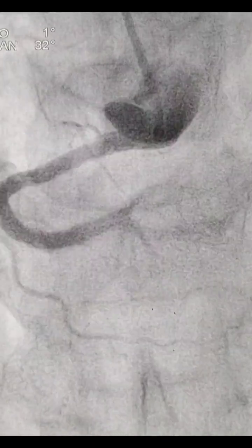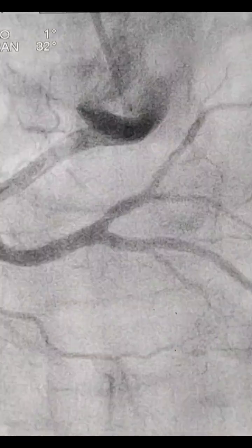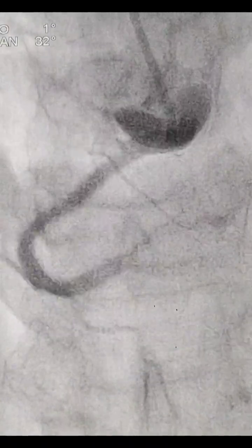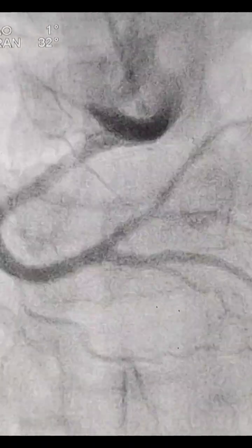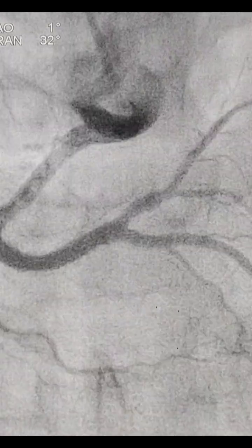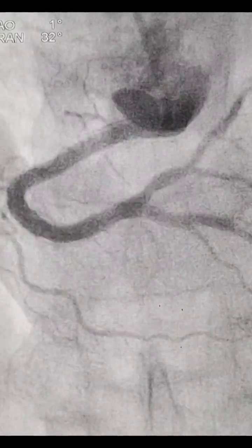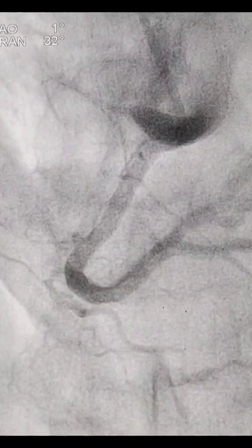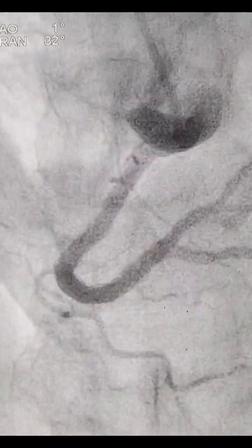But anyhow, I kept this patient for 5 days and there was nothing. So I planned for the CT aortogram for this patient. The patient is stable and we discharged the patient on the 3rd day, and now the patient is good. After 7 days I will do the CT aortogram, and so this was the case of catheter induced aortic dissection in the ectatic RCA angioplasty.